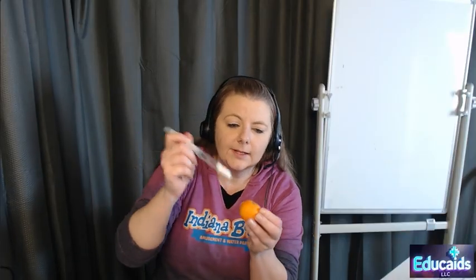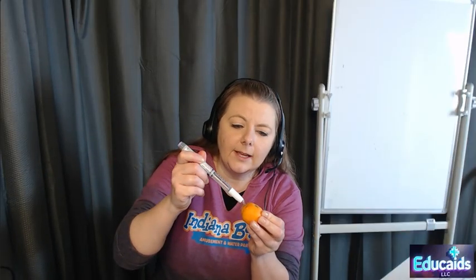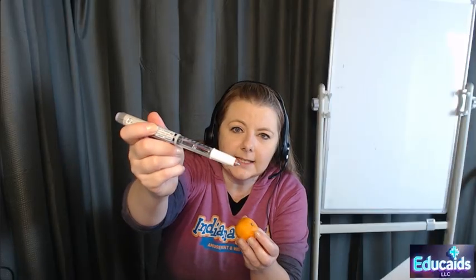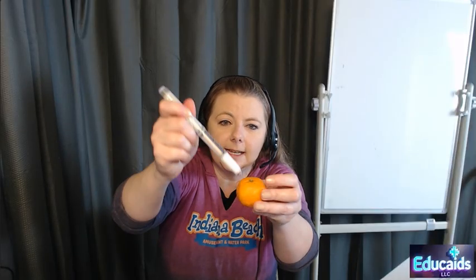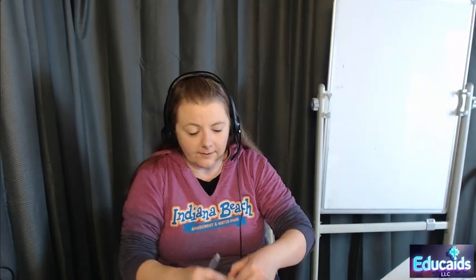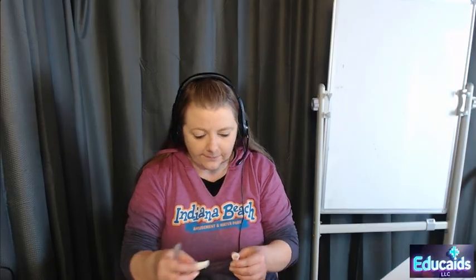You can see what the safety shield looks like. And this is what I was talking about, students. If you go to give it and you accidentally lose contact with the skin, and you see the safety shield is engaged, well, now you can't give your insulin. So you have to take your needle off, and you have to get another needle, because now the patient's not going to get their medicine.